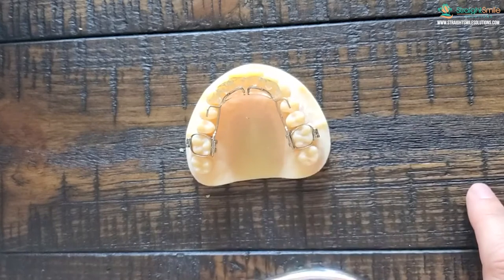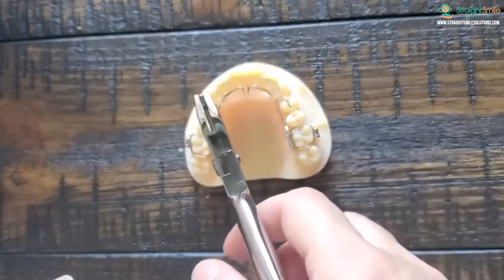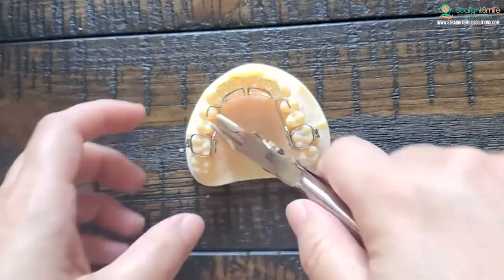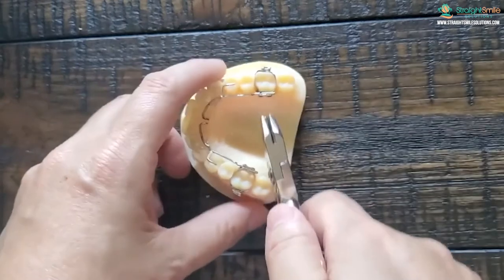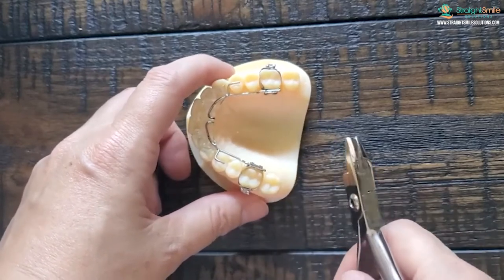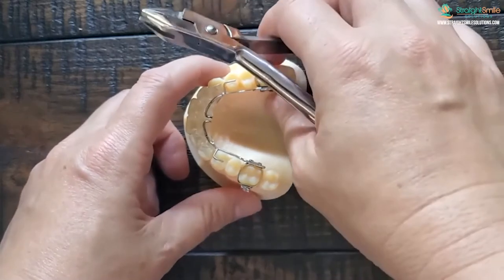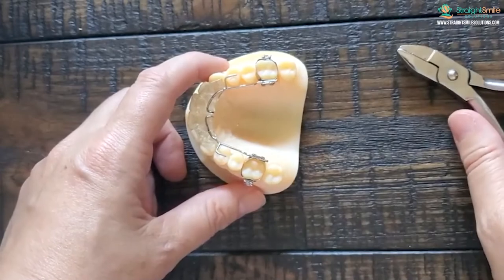Parents are often going to freak out, so they need to be ready for this. If you need to adjust your bite plate, my go-to instrument is the three-pronged plier — give it a quick squeeze here and here to seat it a bit more. Just a tiny squeeze while it's in does wonders. If you squeeze too much, you'll break the seal on the bands, it'll pop out, and you'll have to redo it.